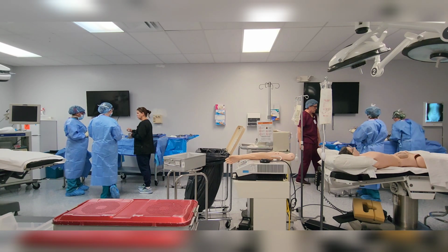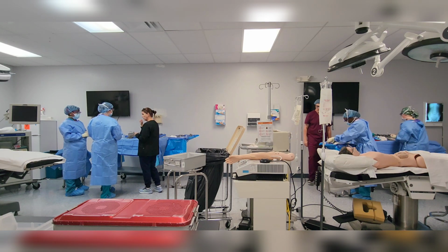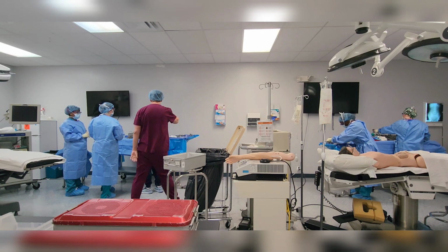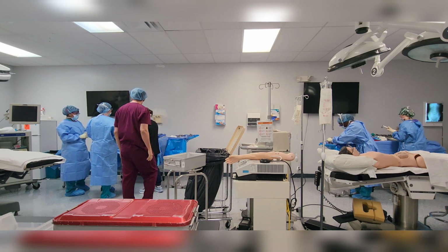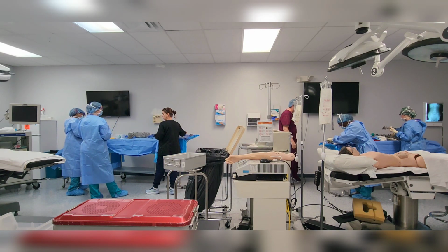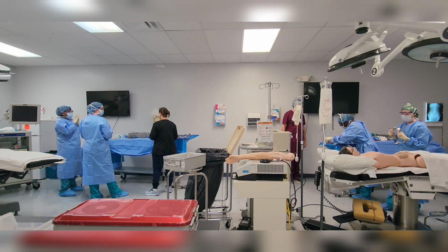They're gonna go in there and rub the cervix and make sure they're grabbing the cervix, finding the os, which is where they need to put the dilators into, and the Sims uterine sound. So they got to go through and measure the uterus. So you're going to use multiple of these for that.